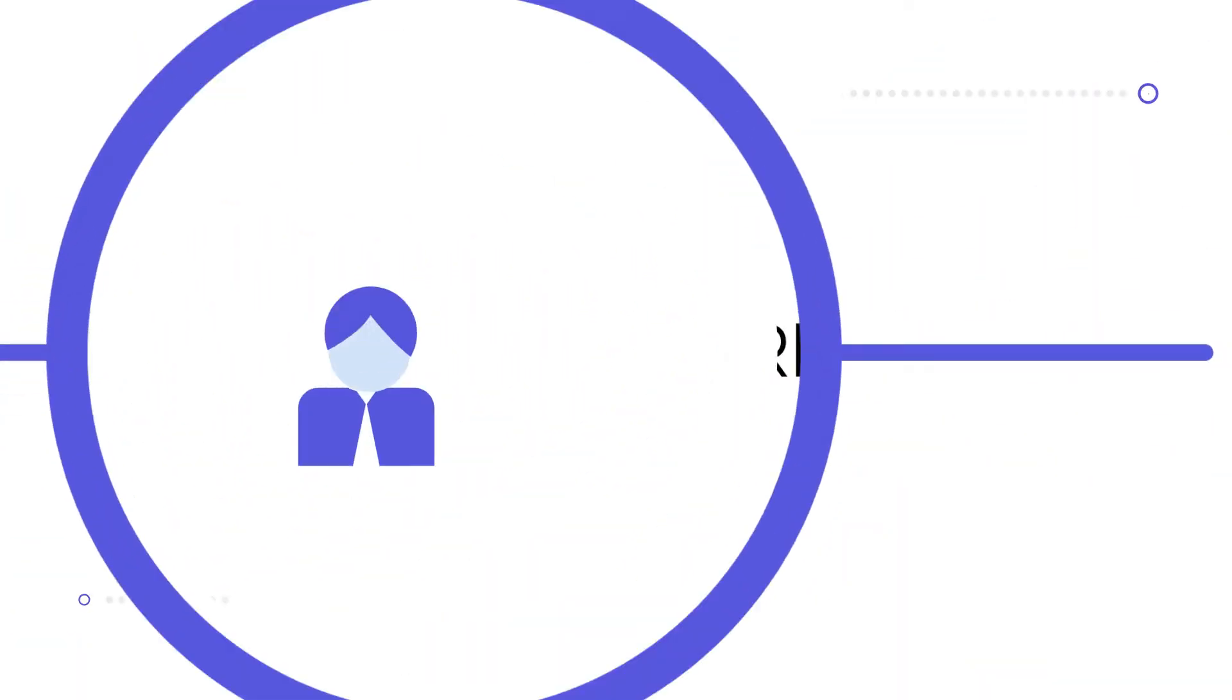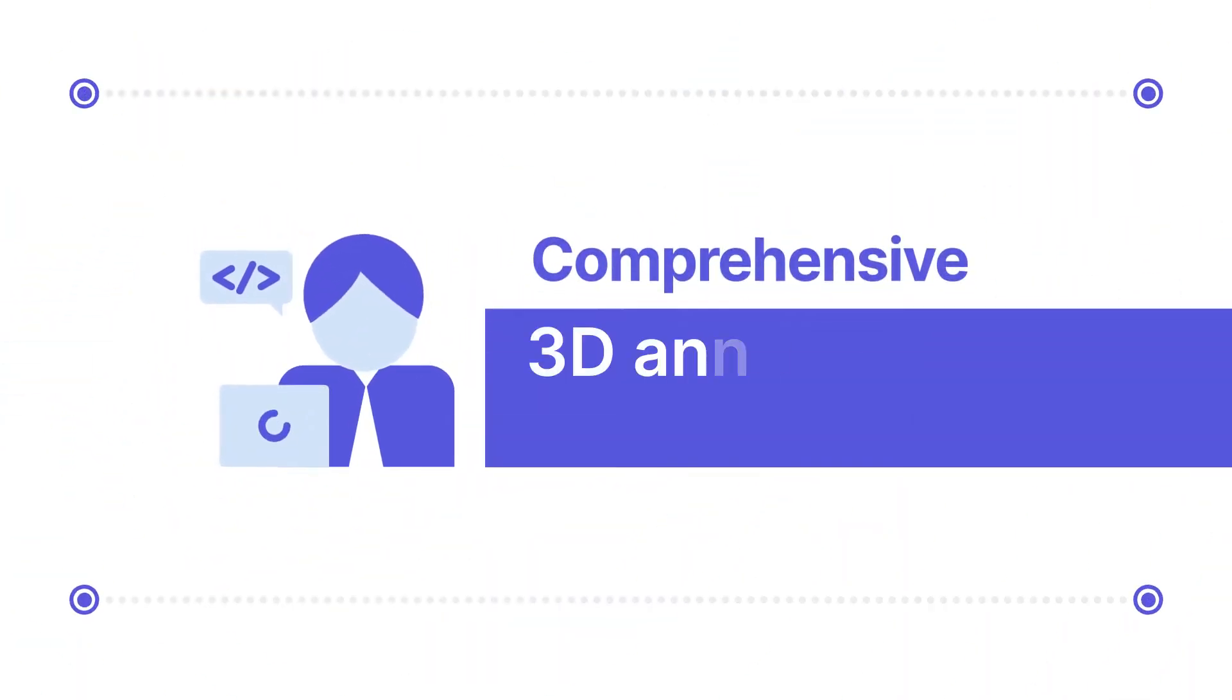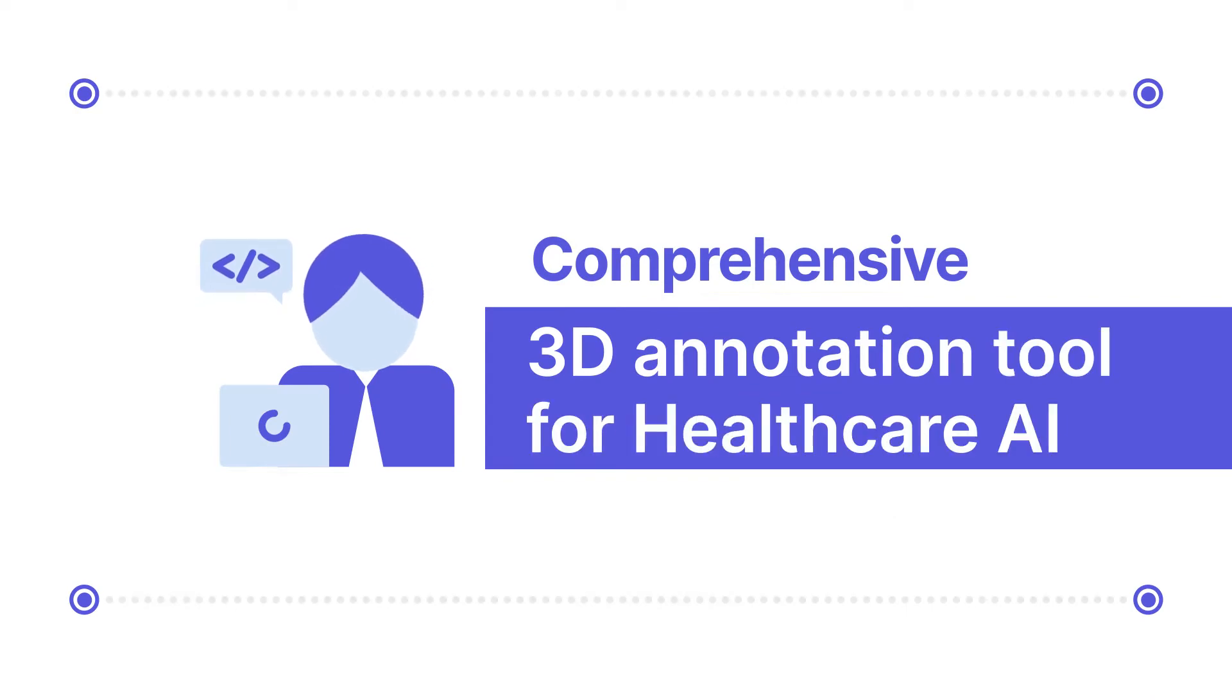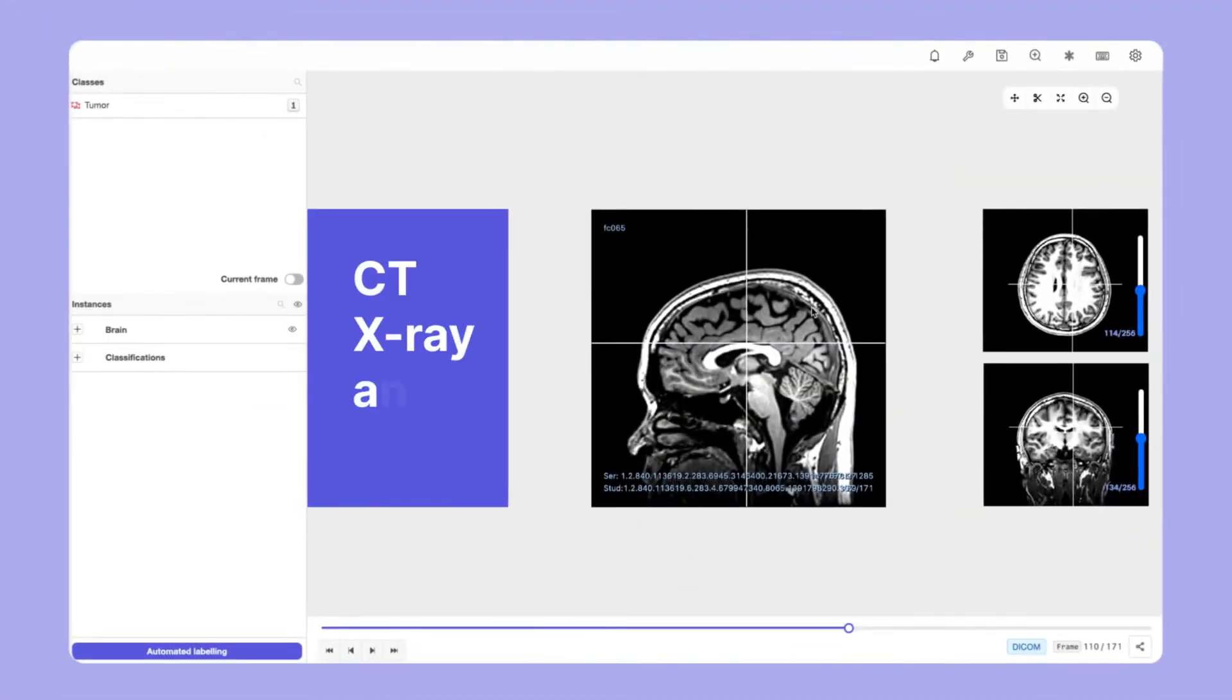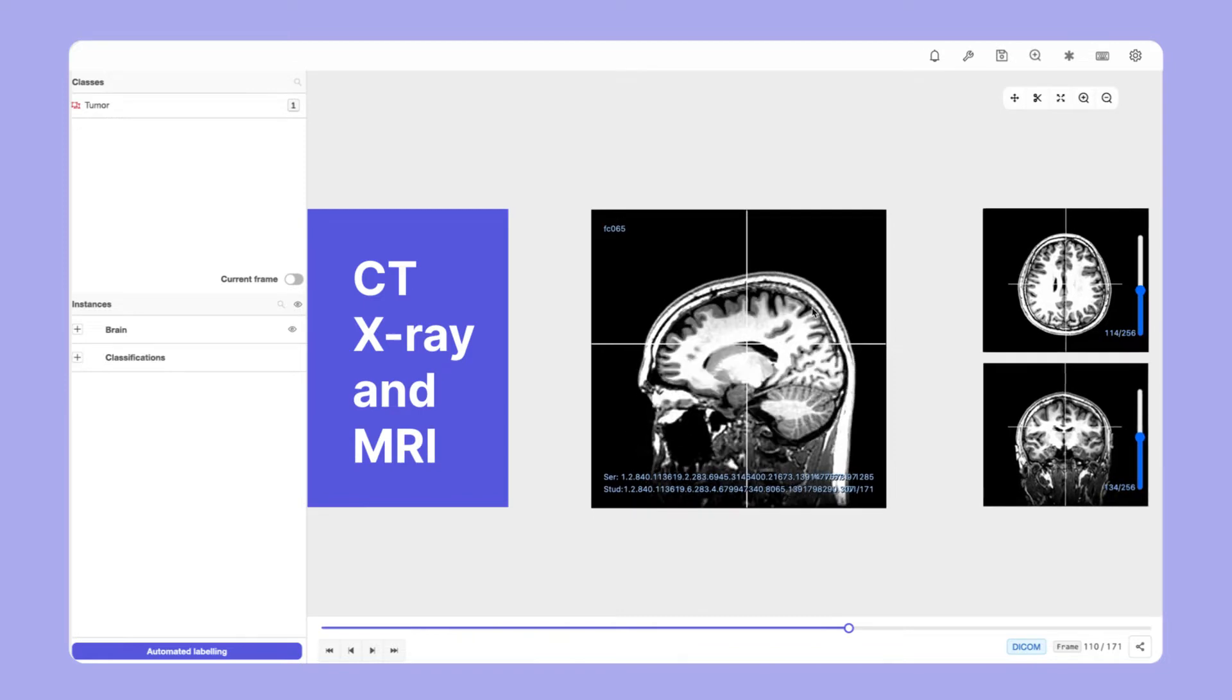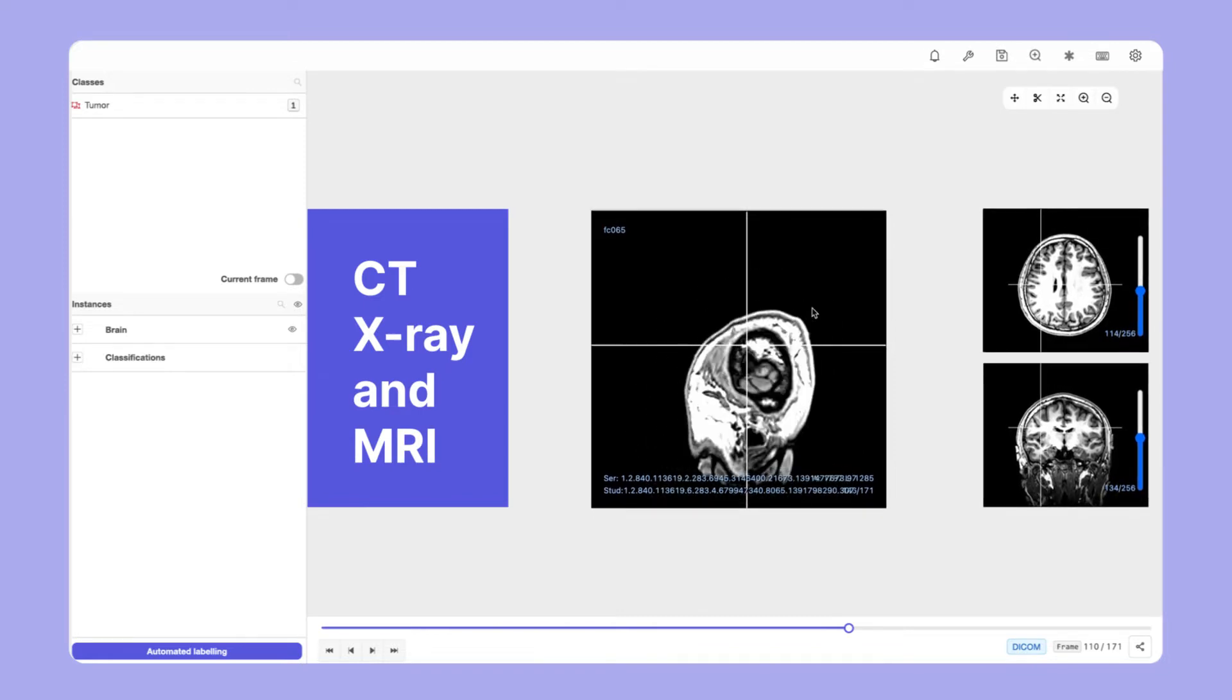Encore's DICOM tool is the first comprehensive 3D annotation tool for healthcare AI. The tool allows annotation for CT, X-ray, and MRI.